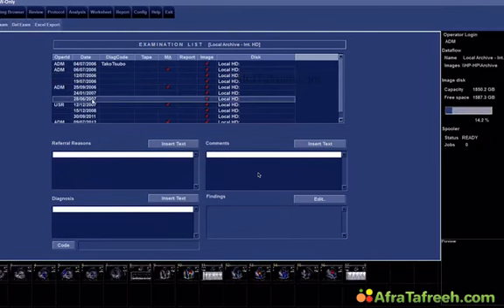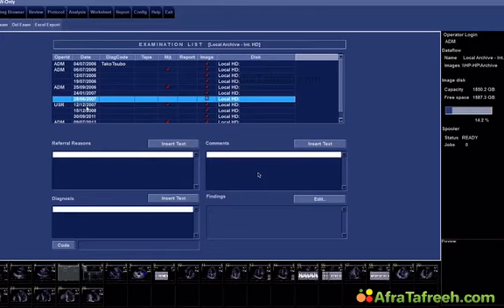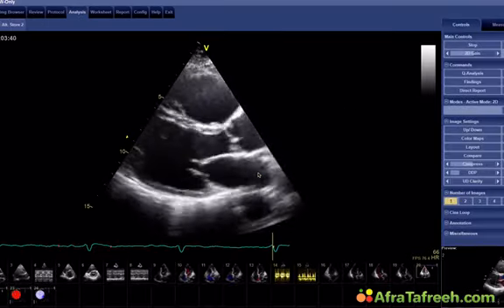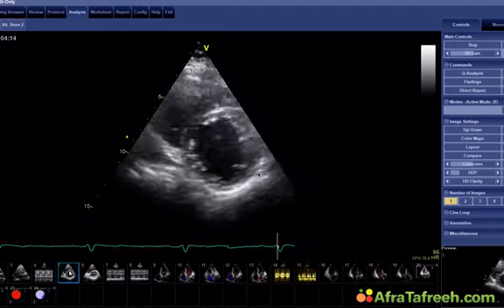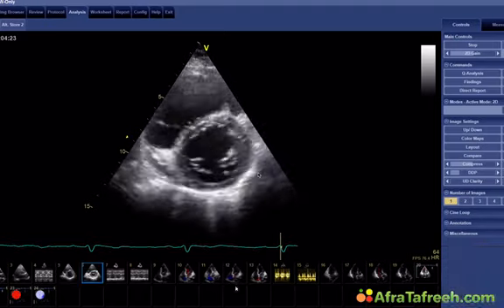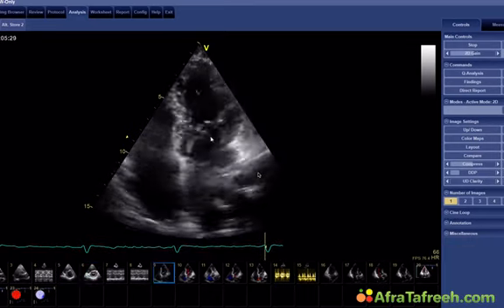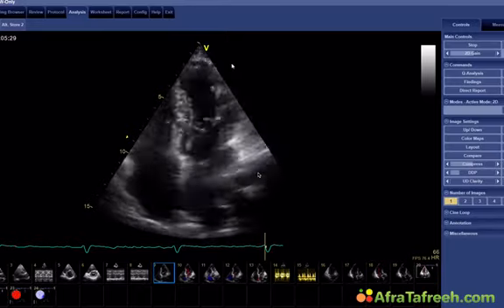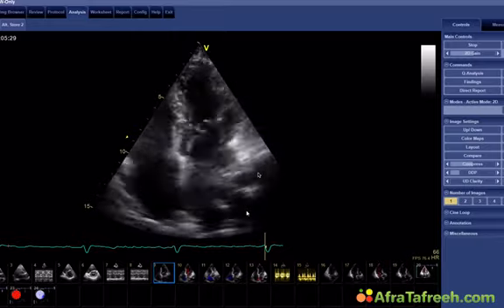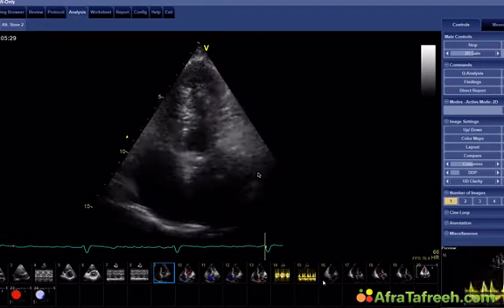And let me go back to the follow-up now, approximately 1 year later. Let me see where that is. Okay. This is 1 year later. Her pipe was fixed, and so is her heart. You see, she now has completely normal left ventricular function. And this is the 4-chamber view. You would not think that the patient ever had such a pathology. So in contrast to myocardial infarction, there is no scarring, and it's a completely reversible process, which is actually also part of the definition of Takotsubo syndrome.